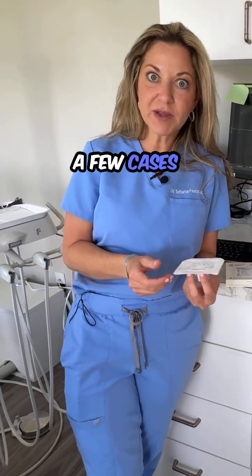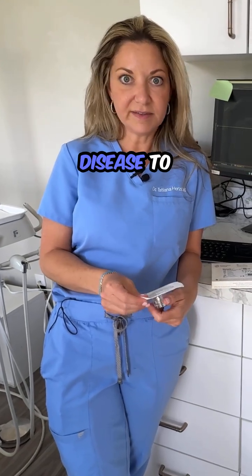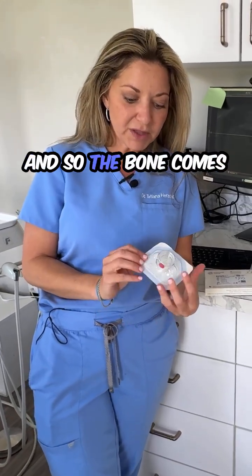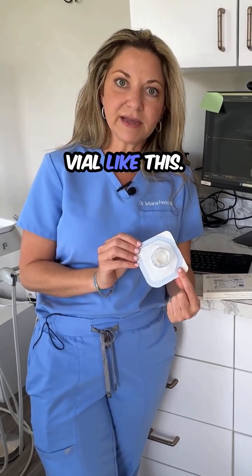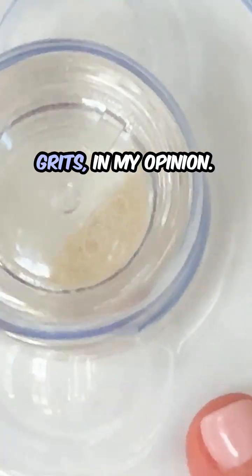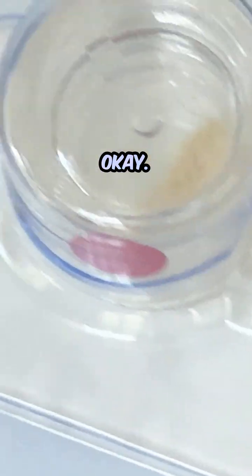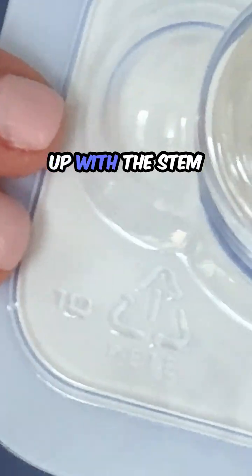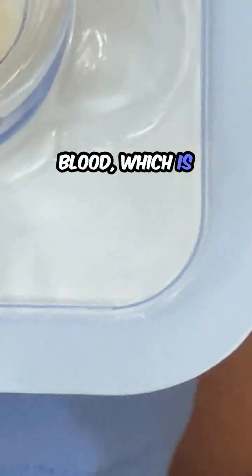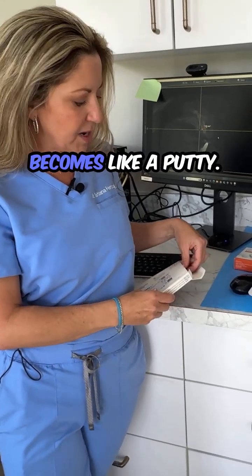There's only been a few cases reported on actually transferring any kind of disease to a patient — it's extremely rare. The bone comes in a little vial like this. It looks like dried grits, in my opinion, and it comes in a particulate. This gets mixed up with the stem cells from your blood, which is called PRF or PRP.